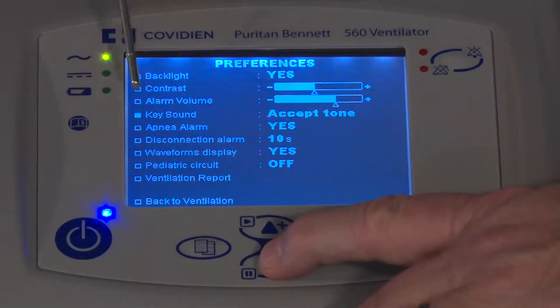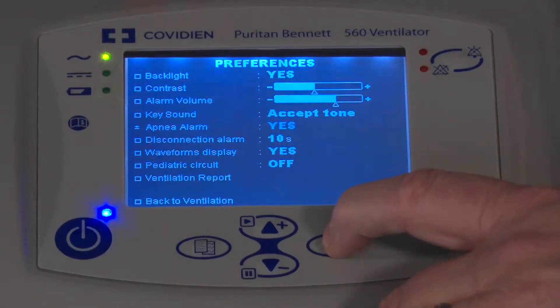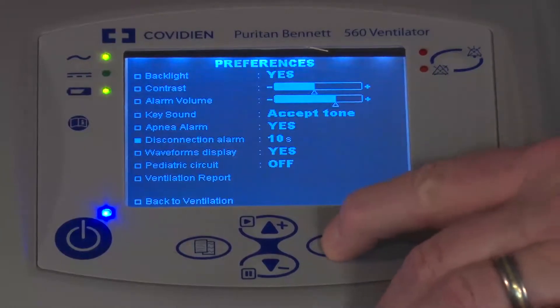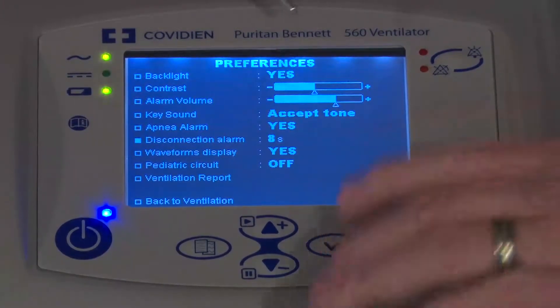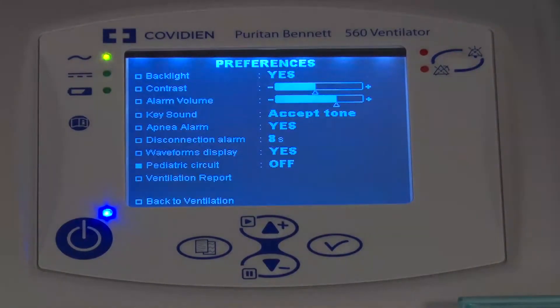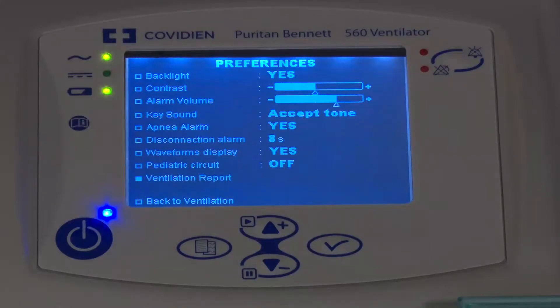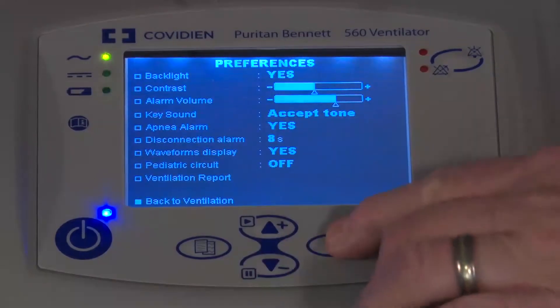You can also determine the key sounds. There's an apnea alarm — make sure you want it on or off; I'll leave it as yes. Disconnect time sets how long before a disconnect alarm goes off. Do you want to show waveform displays? Yes. If you have a pediatric patient, you would check the pediatric circuit option, which accounts for volume lost in the circuit. There are also options for ventilator reports you can send out the back.